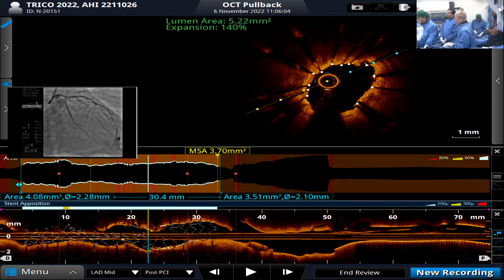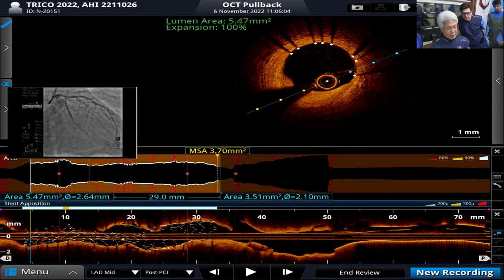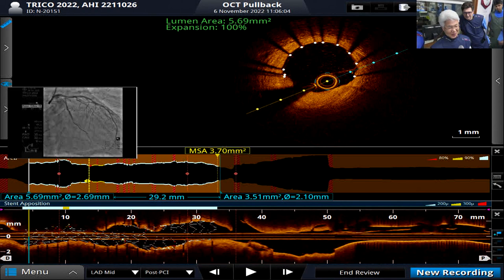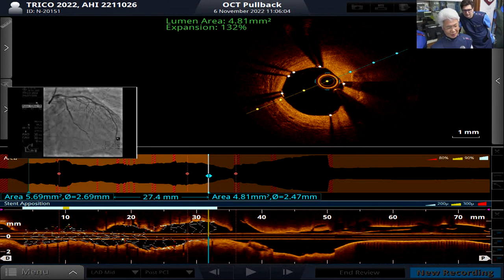That's right. Therefore, I tried to change the position a little bit proximal, as you said. Right, 80% around. This makes me feel better. I appreciate you doing that. Right, 77. Yeah, it is important to identify the real proximal and distal reference, right?